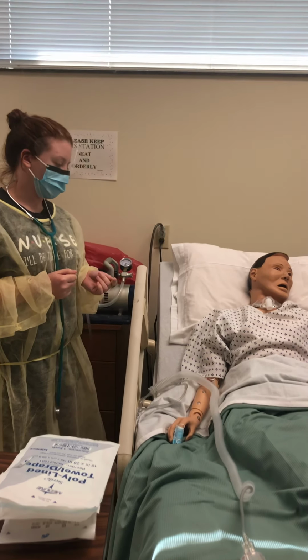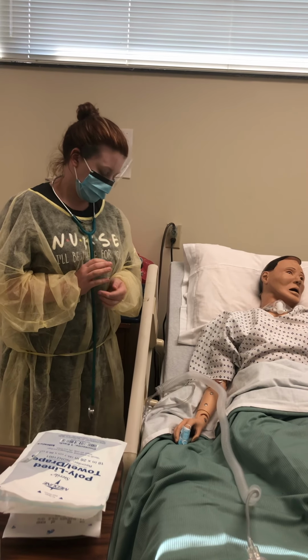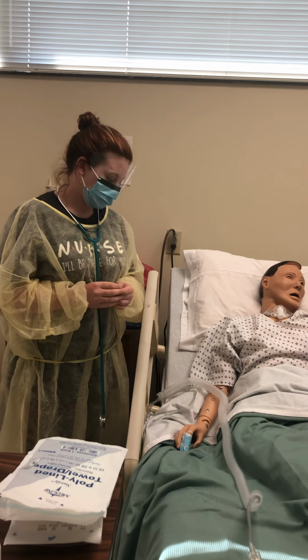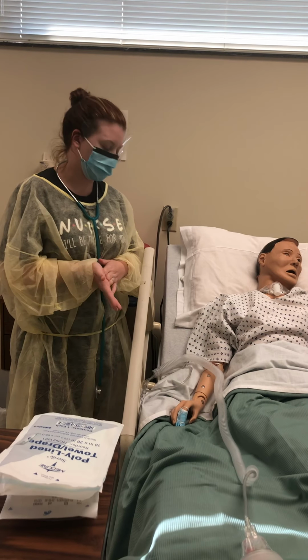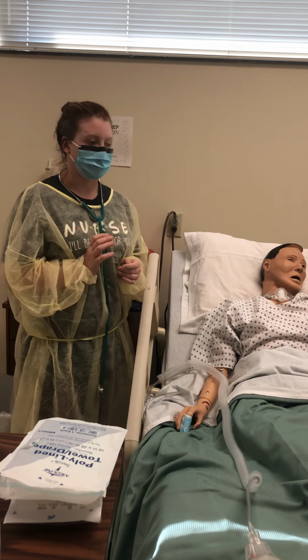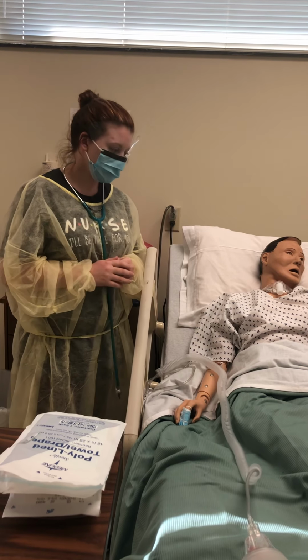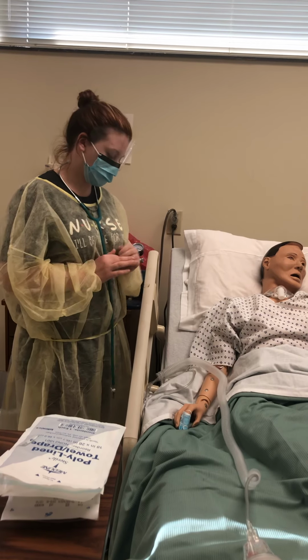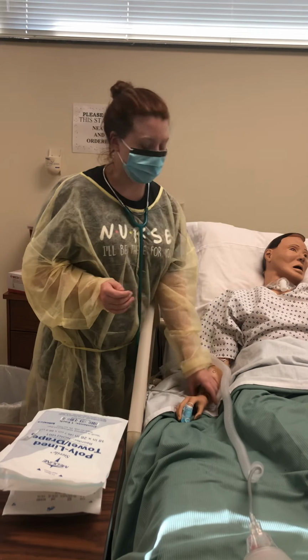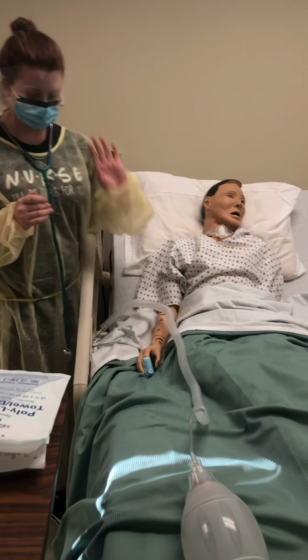I'm going to establish communication with him, and I'm going to tell him that if anytime he needs me to stop, or he becomes uncomfortable or increases in shortness of breath, for him to raise his hand. And I'm going to ask that he return demonstration, and he can raise his hand, so I know this method of communication will be effective.